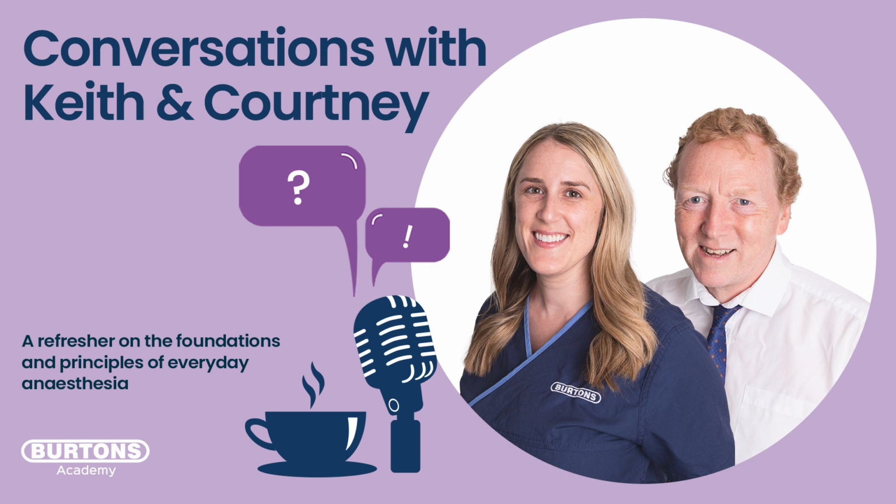So I would then increase the tidal volume slightly and look at the end pressure, the peak inspiratory pressure. So let's say 25 kilo dog, you want 250 mils. Let's make that 280 mils. See what our end tidal CO2 is when we carry on with that. And that should come down again because we've increased the minute volume. So we use our capnograph to dictate what we do with our minute volume. The simplest control is respiratory rate. The secondary is tidal volume if we've not been delivering quite enough.